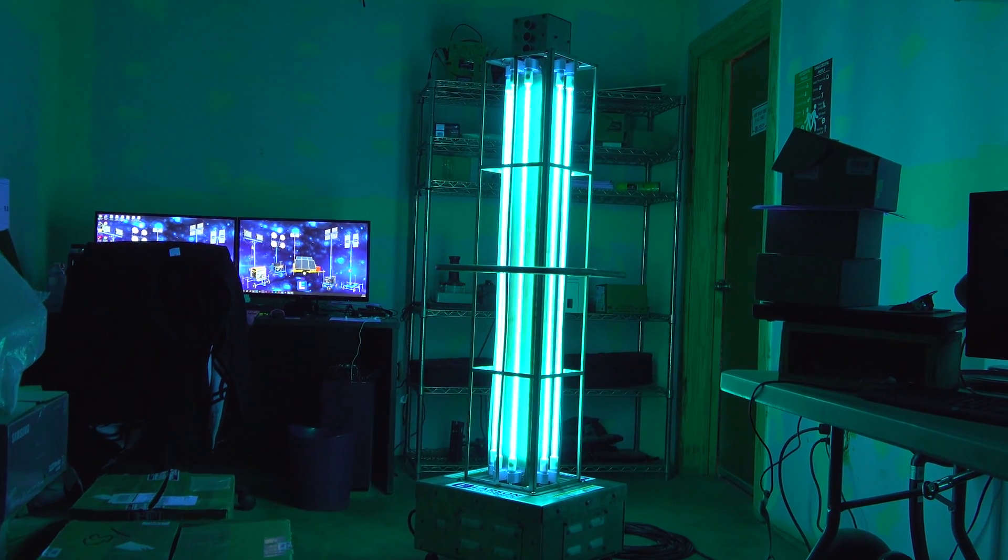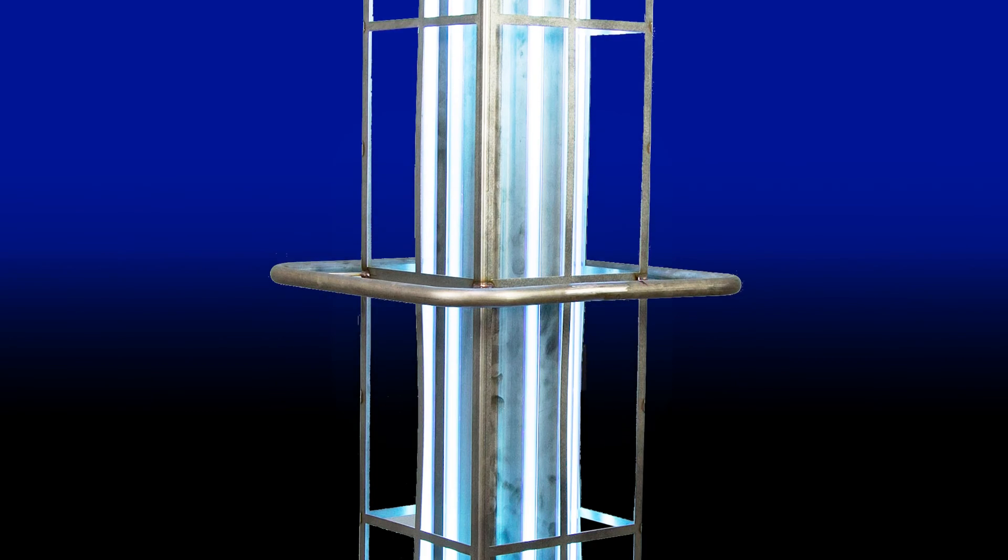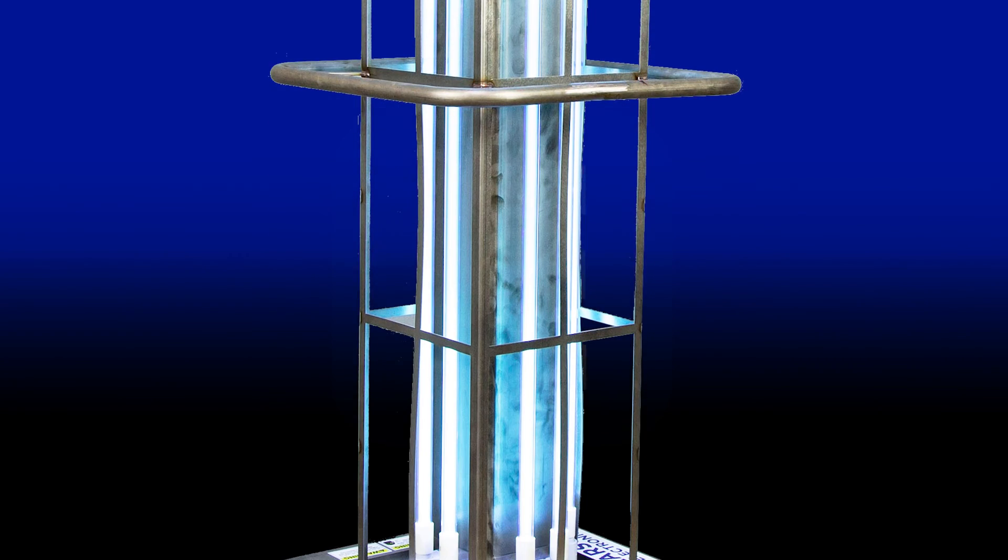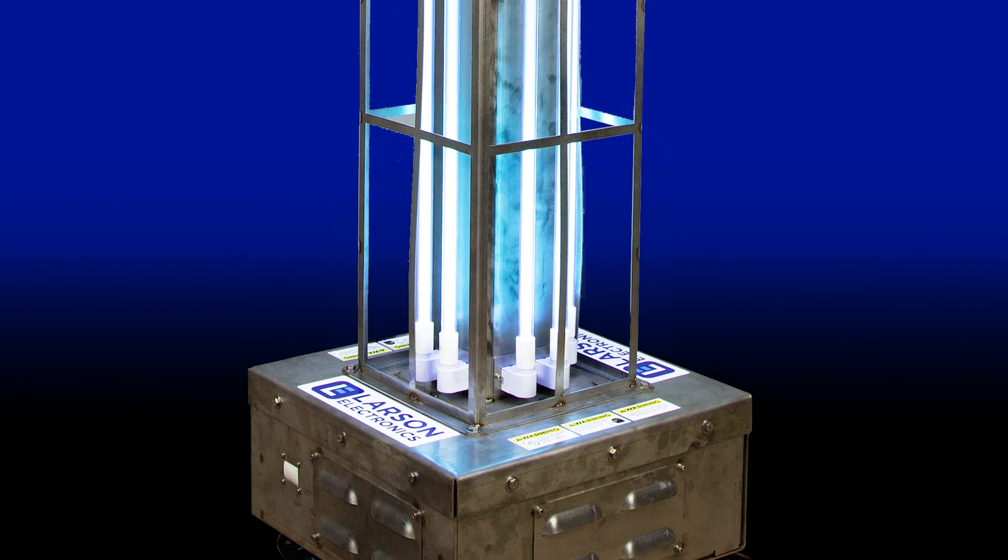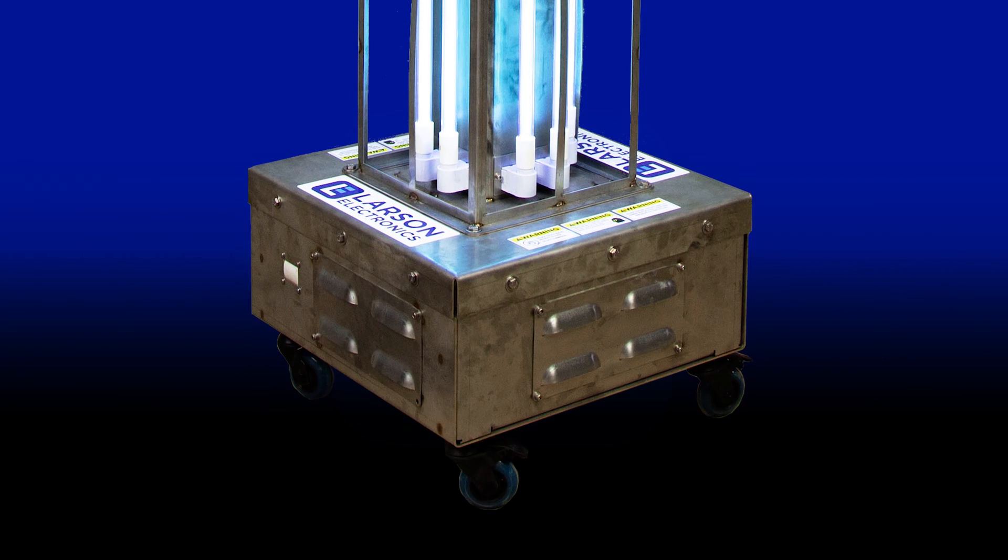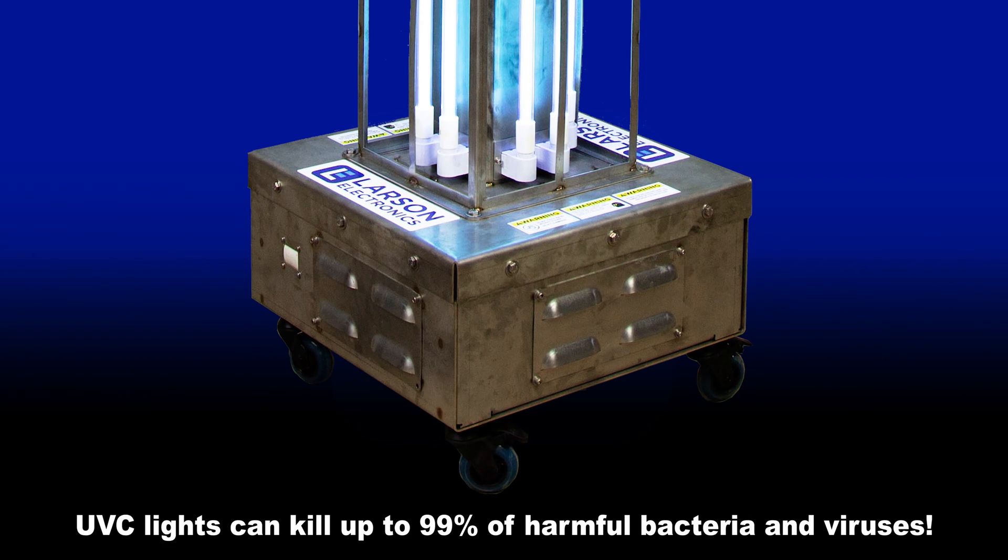Larson Electronics carries a wide variety of powerful UVC Sanitation Carts that offer 360 degrees of coverage for a variety of applications.